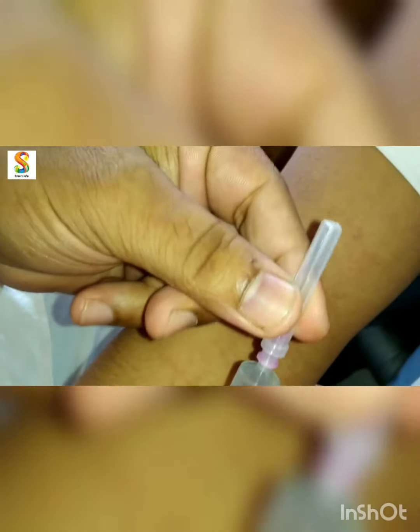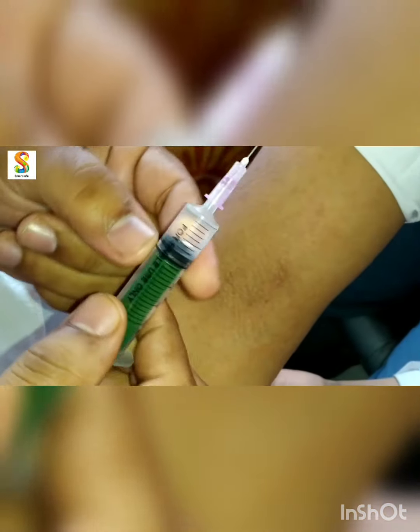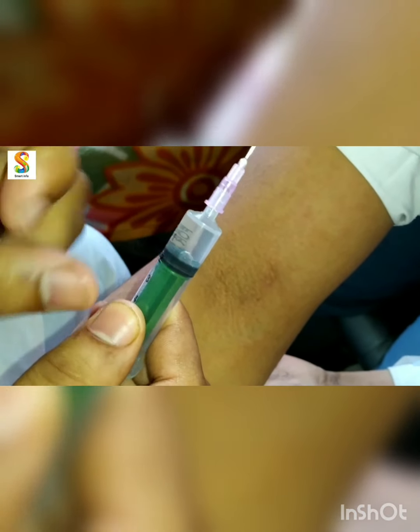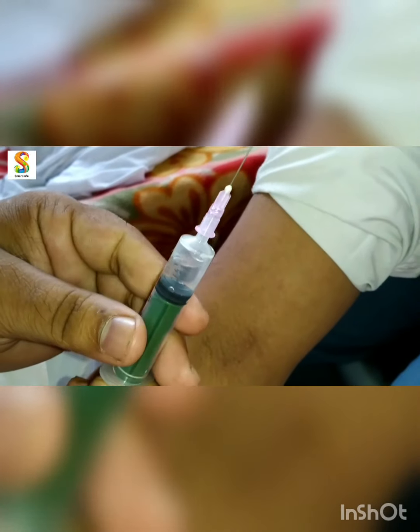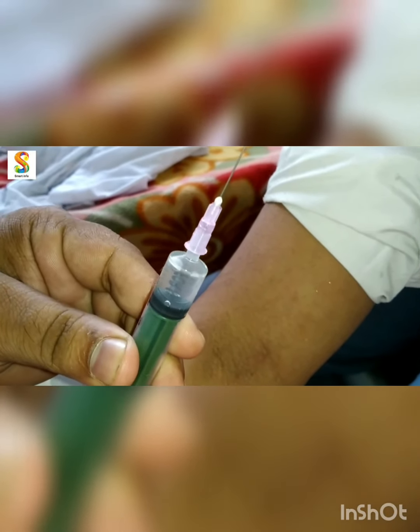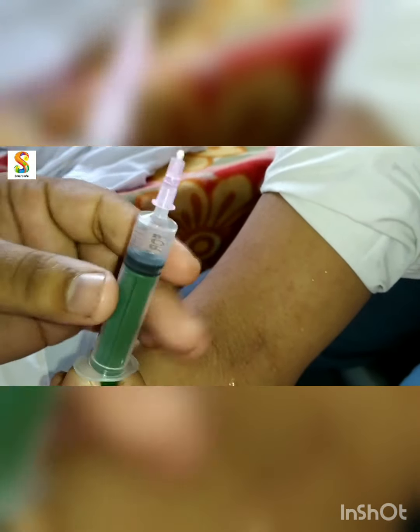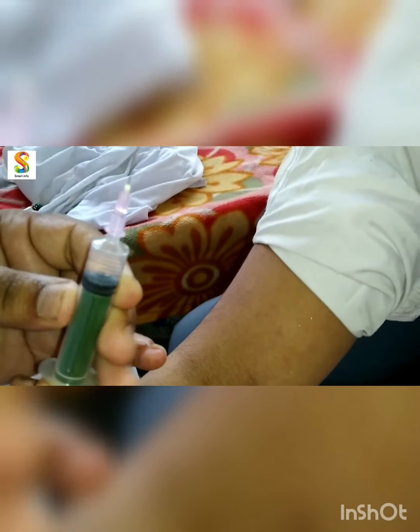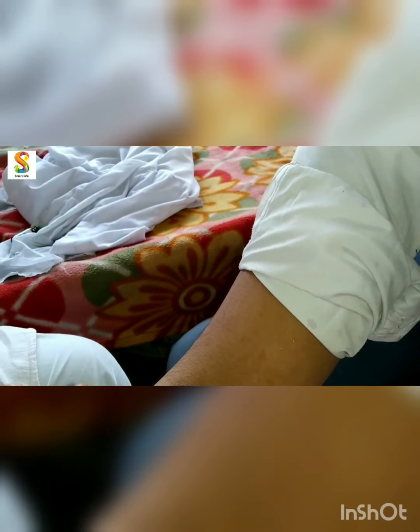Now if you can see the person's veins, they are prominent here. As you can see, it's prominent here. Before this, you can see there is an air bubble inside the syringe. We first need to remove that air bubble like this, so that we make sure that there is no air bubble inside the syringe. You can see there are air bubbles. Let's try to remove that.